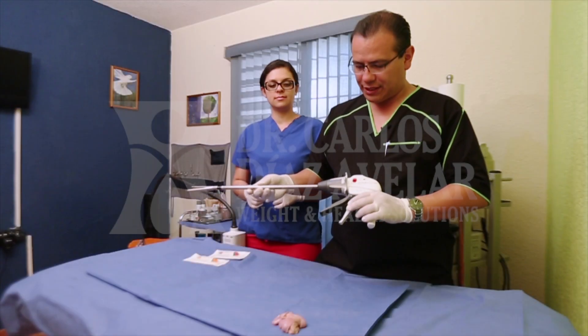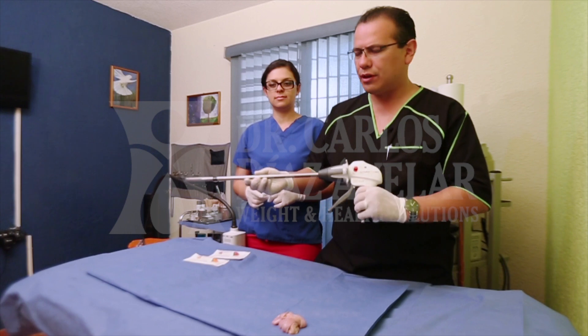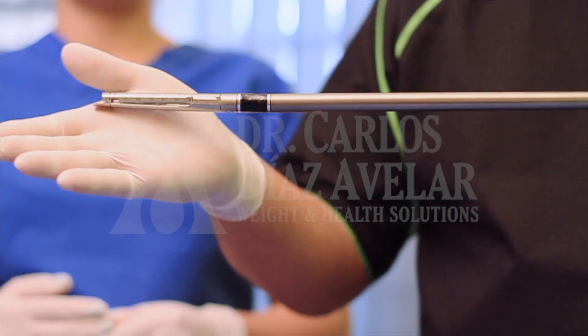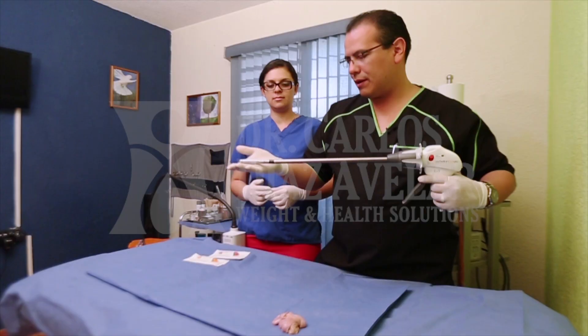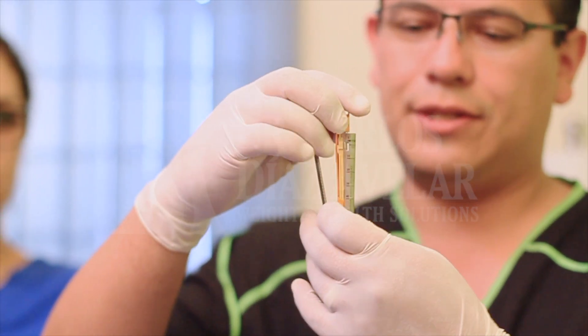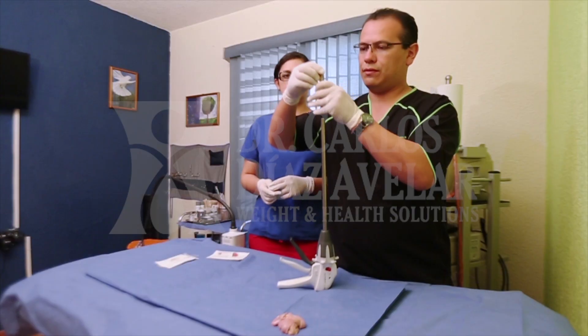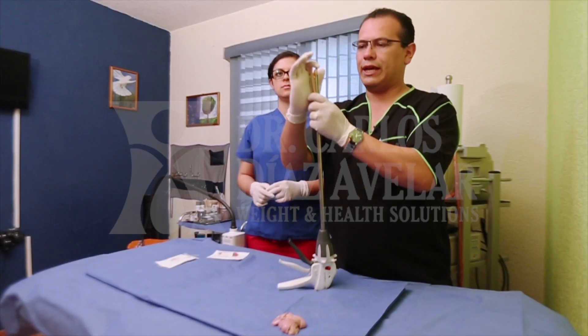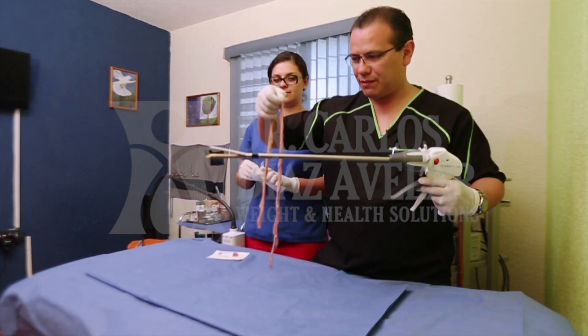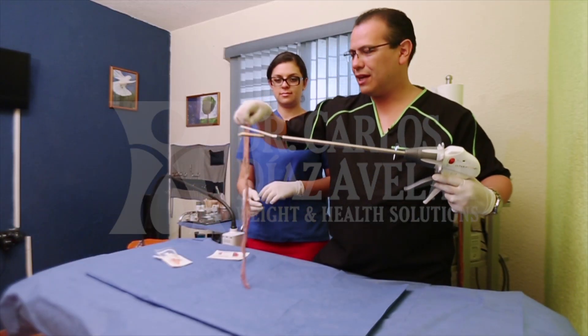This is a demonstration of how the Johnson & Johnson Eticon stapler works. We are going to see how Dr. Villas performs and explains the surgery by cutting an animal intestine. Dr. Villas only uses Johnson & Johnson Eticon products, and these products are always new. As you can see, Dr. Villas has an animal intestine and he is going to cut it.